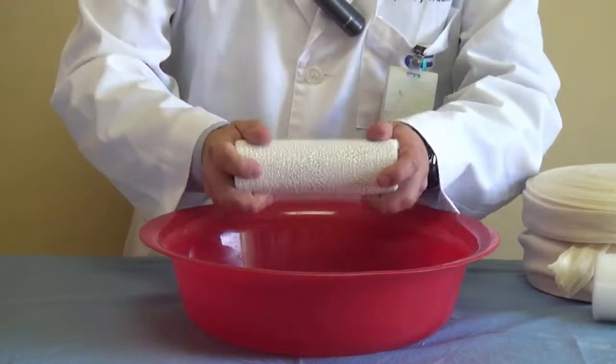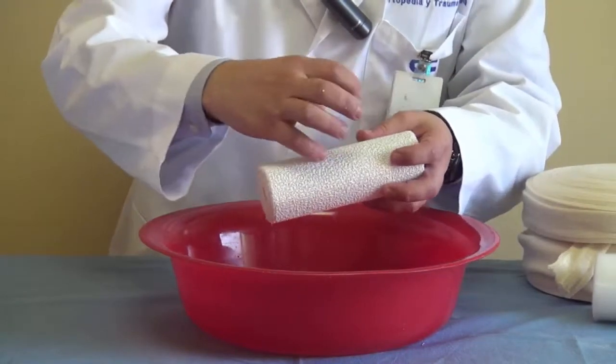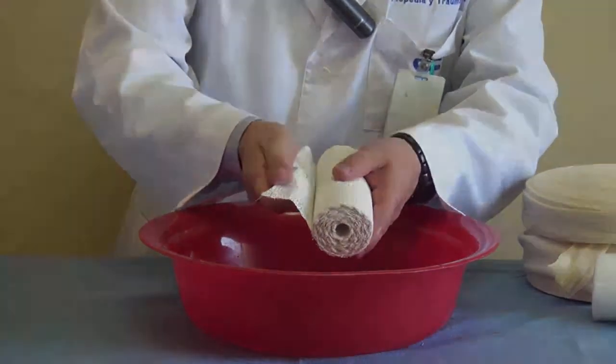You take the cast and put it inside all together. You don't mix it or go around in order to avoid losing the cast material. And you always have to hold the end in order to avoid losing it.